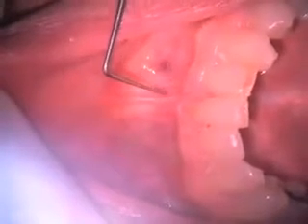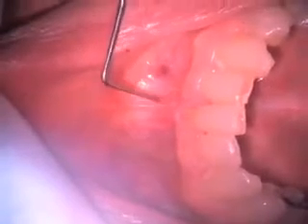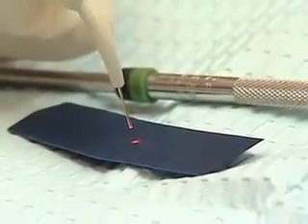There are actually two muscle attachments present that we're going to revise. The first procedure will be to clamp the section that I want to excise of the frenum. We're going to initiate the laser tip by touching it to a piece of plain articulating paper. We'll use the clamp as a physical surgical guide for removal of this tissue. Very little charring is evident here as we begin the excision. We have removed the proximal area and made an incision. Now we're going to remove the labial section of the frenum. I'm using 0.9 watts continuous wave so that we have a minimum of charring and a minimum of post-operative pain.